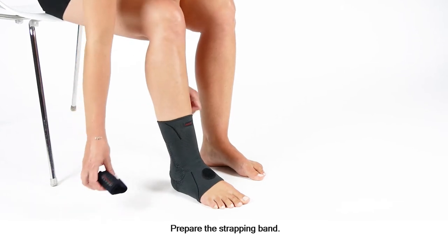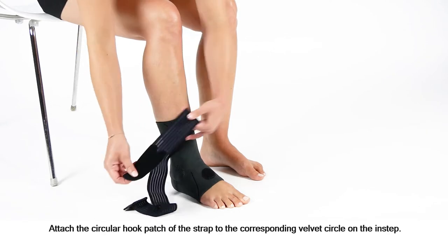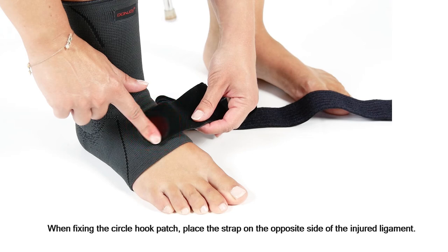Prepare the strapping band. Attach the circular hook patch of the strap to the corresponding velvet circle on the instep. When fixing the circle hook patch, place the strap on the opposite side of the injured ligament.